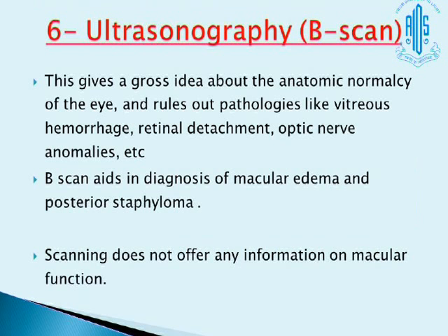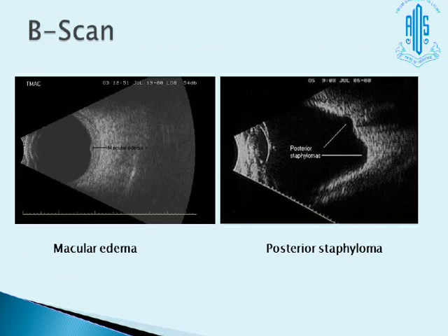Lastly is ultrasonography B-scan. We don't rely on it very much, just to give an idea about the macular edema and posterior staphyloma.